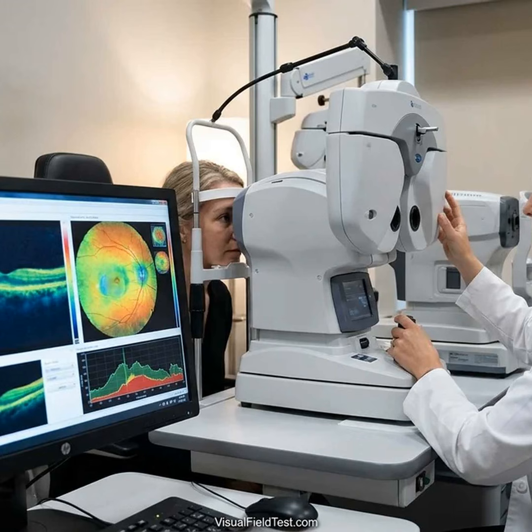For reliability, OCT is very precise, but it can have false alarms. Random scan-to-scan fluctuations do happen. That's why doctors look for consistent trends, often requiring 2 or 3 scans before concluding progression. Modern OCT machines often include event and trend analysis, like guided progression analysis, GPA. An event flag might light up if 3 points worsen on 2 consecutive scans. A trend will look at each visit's thickness over time. These must be interpreted with all other information in mind.